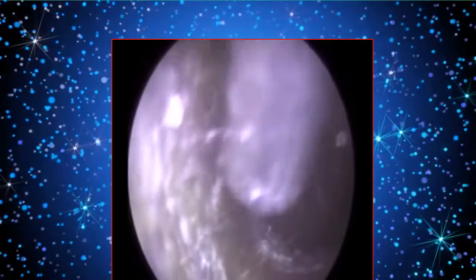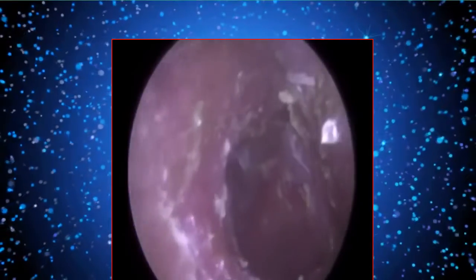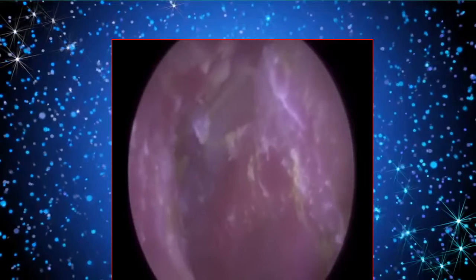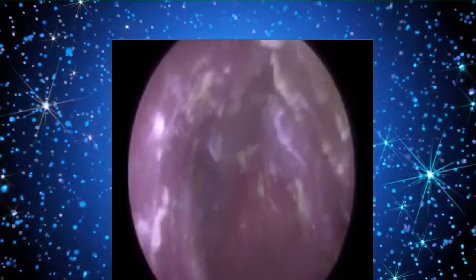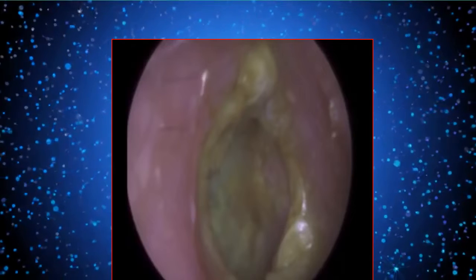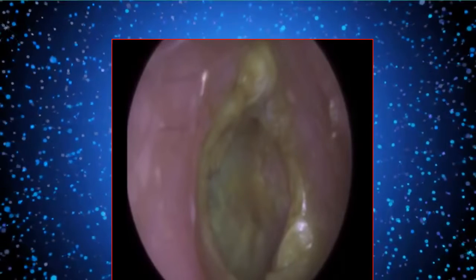So again, just sort of up that. Again, we don't want to cut the ear canal, the lining of skin, because then that's going to introduce another infection. So we're again trying to treat one infection without causing another. So there's the patient's eardrum, just a bit bulged superiorly. There was a bit of fluid there, we suspect. So that's the before, and you'll see the after image.